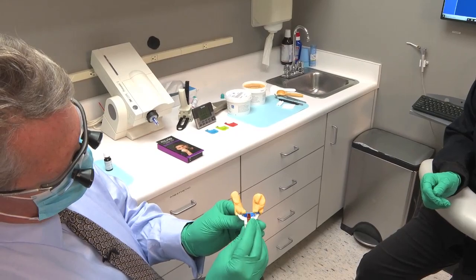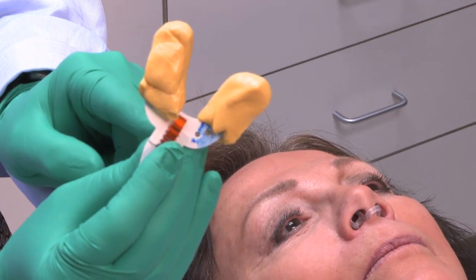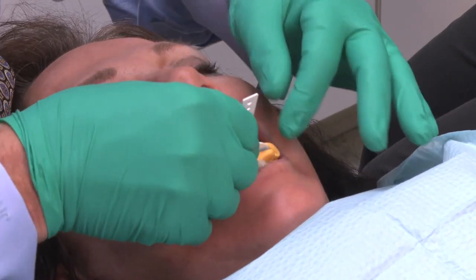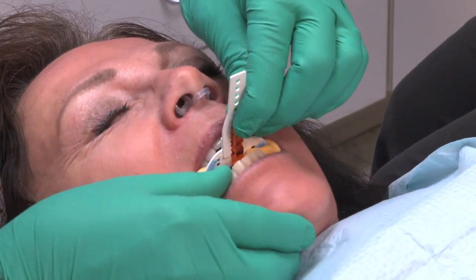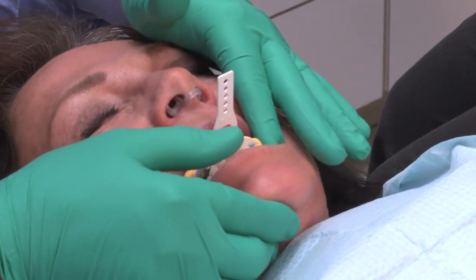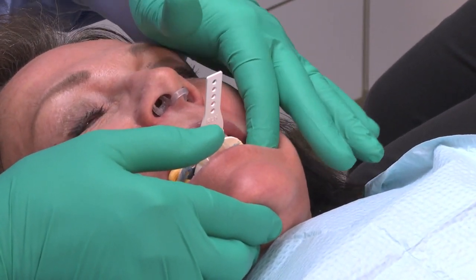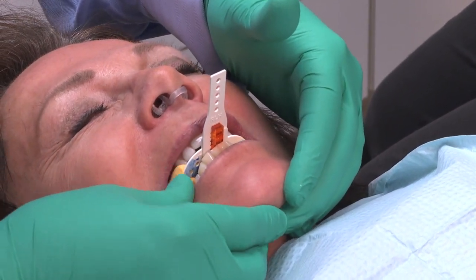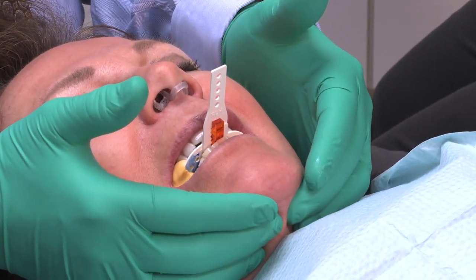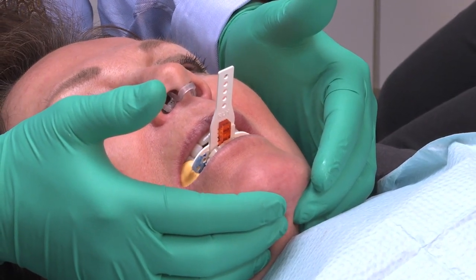Okay, our Panasil putty is now on our bite fork. We will seat the middle notch over her maxillary teeth, and her mandibular teeth will go into the bottom notch, and that will be edge to edge. Good, close back a little bit. Perfect. And you want to hold her chin, border mold the material in place with your fingers so you get nice contours. And we'll simply hold her chin so she doesn't open while the putty dries.